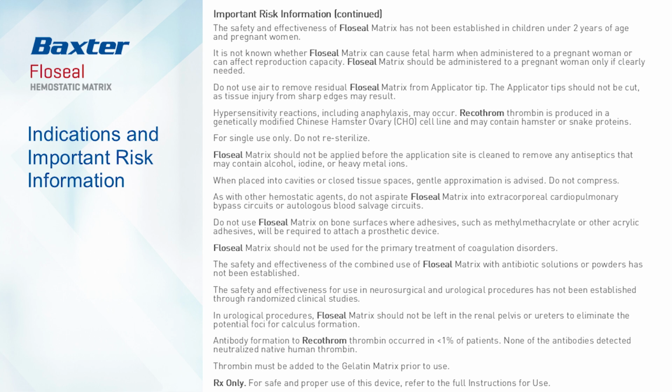The safety and effectiveness of FLOSEAL matrix has not been established in children under 2 years of age and pregnant women. It is not known whether FLOSEAL matrix can cause fetal harm when administered to a pregnant woman or can affect reproduction capacity. FLOSEAL matrix should be administered to a pregnant woman only if clearly needed. Do not use air to remove residual FLOSEAL matrix from applicator tip. The applicator tips should not be cut, as tissue injury from sharp edges may result.